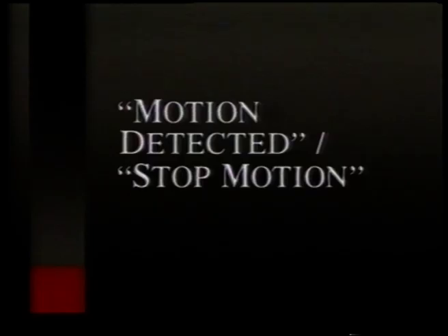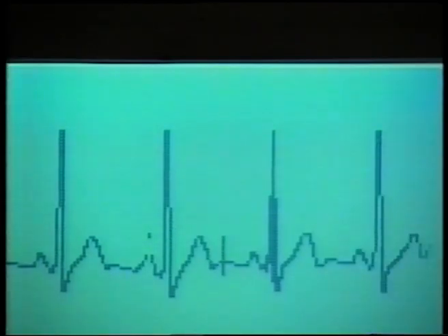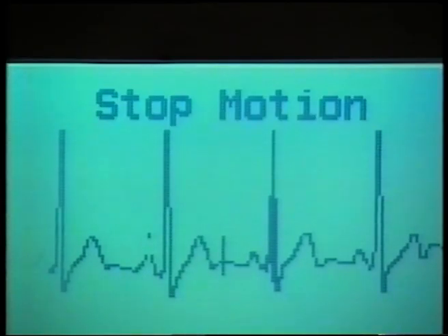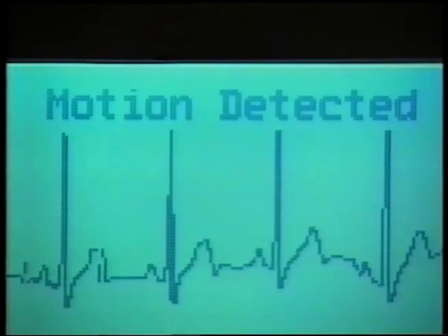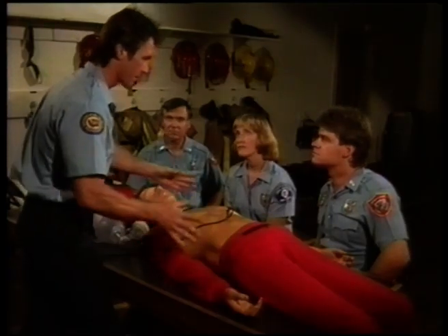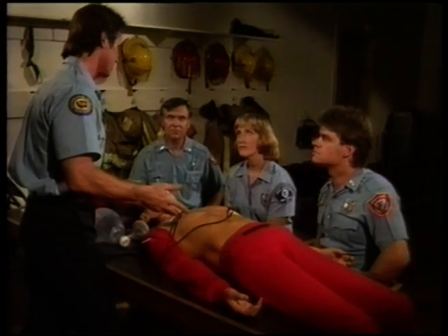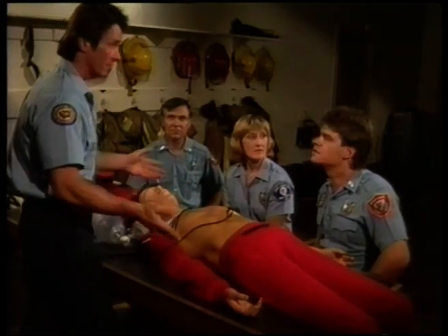Motion artifact is a term used to describe the ECG signal distortion created by patient motion. Motion artifact can inhibit analysis of ECG. If motion is detected during analysis, motion detected and stop motion messages alternately flash. If these messages appear, check to see that the patient is not moving and that no one is touching or moving the patient.